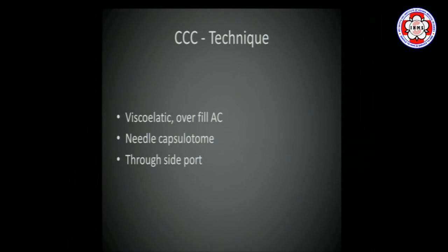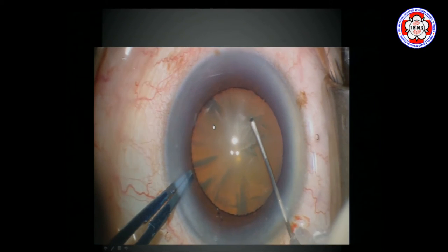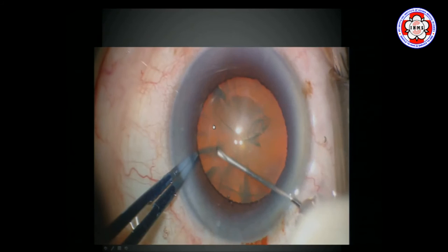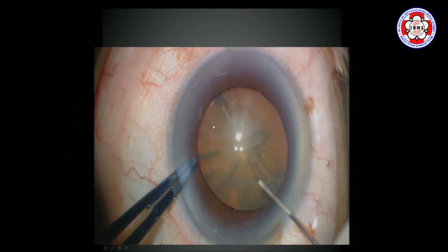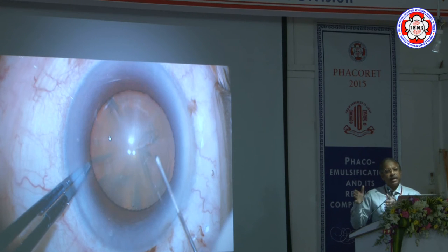Fill viscoelastic in the anterior chamber — overfill. I do a needle capsulotomy through a side port. You can cut downward, upward, or sideways; I prefer going sideways. Turn the flap down and put it flat — that is most important. Flatten the flap; don't let it stand up or bunch up. Keep it absolutely flat. Like walking a dog on a leash, you hold it and guide it in one circle. Take it along that circle. Even toward the end, try not to let it bunch up. The tearing edge should be seen very well; don't let the tearing edge bunch up.